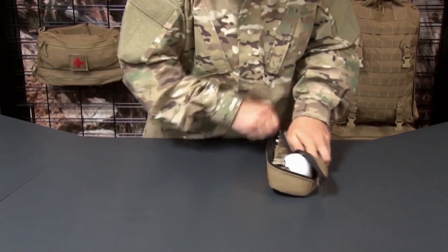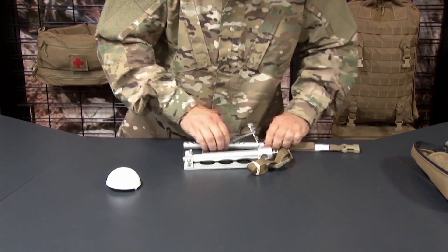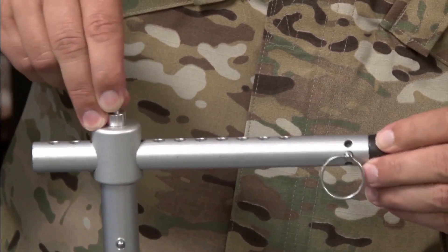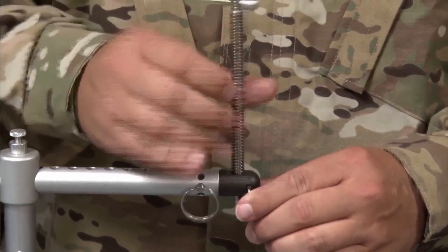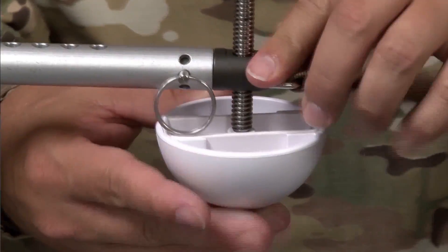To assemble the Croc, remove it from the carrier pouch. Rotate the vertical arm up from the base plate. Lift the horizontal arm locking pin and insert the horizontal arm. Insert the T-handle into the horizontal arm head and rotate clockwise until seated. Attach the pressure disc head to the T-handle.